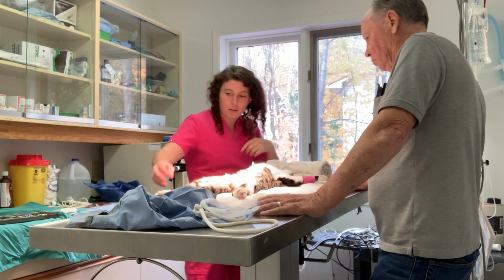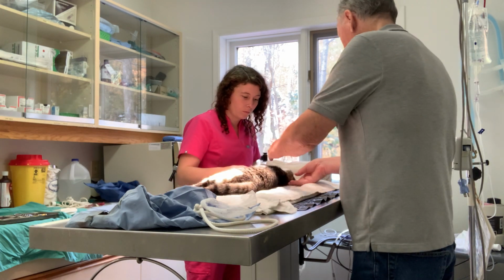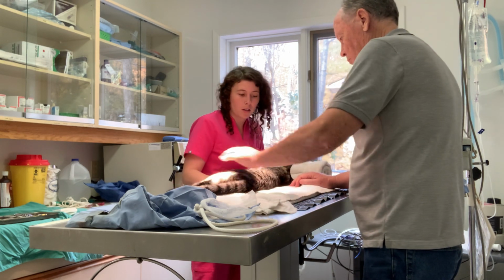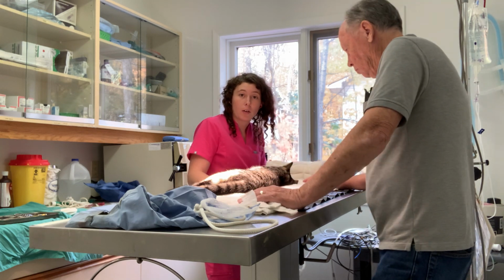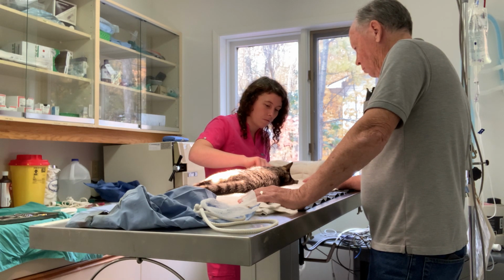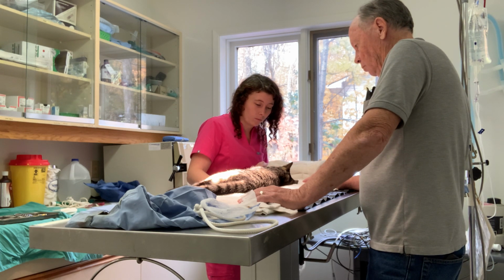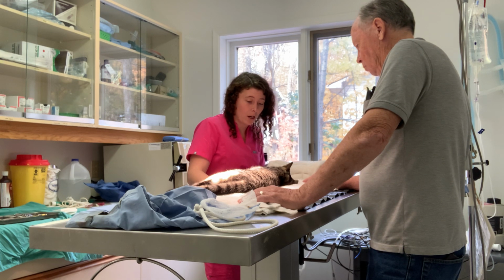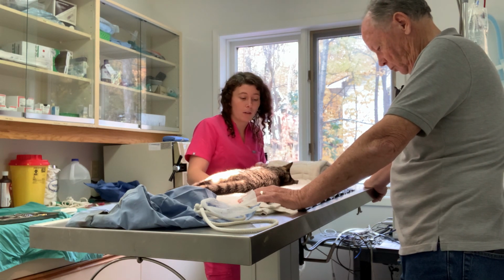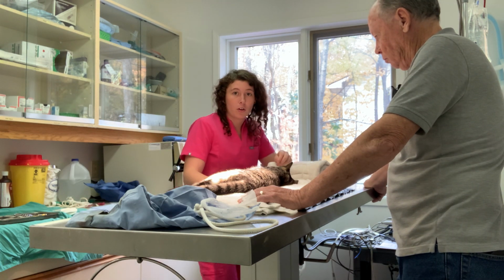Still don't have a palpebral reflex, and I still don't have a pedal reflex. Now it's important to try not to move the animal a lot when it does have an endotracheal tube in it, so we want to make sure that we're not moving it around a lot at this point, but we are still checking for the reflexes. In a cat here, we're trying to wait until we have a little bit of a swallow reflex as well. You can get a palpebral reflex before you get the swallow reflex, and we don't have that swallow reflex yet. But we want to make sure that we're standing and we're ready.